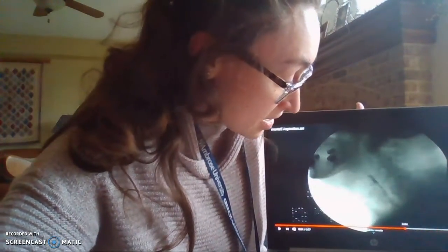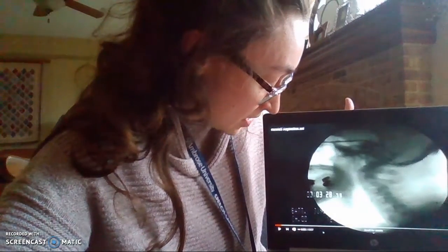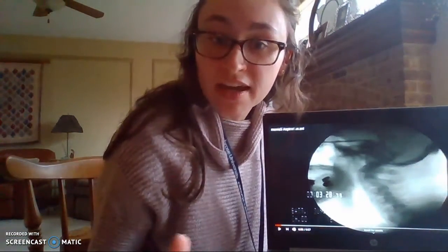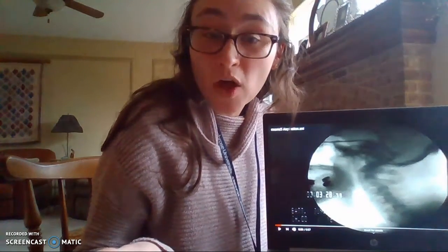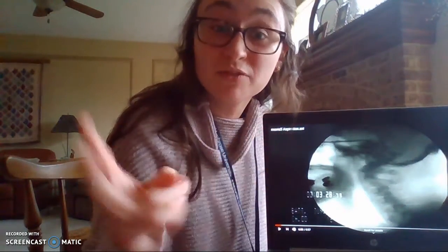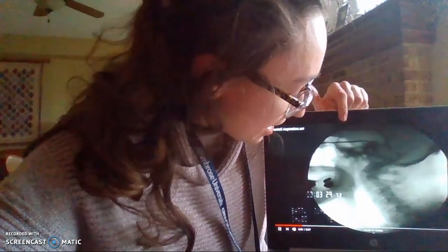So that is a sign of aspiration, and during the swallow today, I asked you if you felt everything go down okay, and it seems like you didn't notice anything abnormal, and so I think that falls into silent aspiration, where you didn't really feel that tickle, didn't really feel like it went down the wrong pipe, per se. And so we can watch it again.